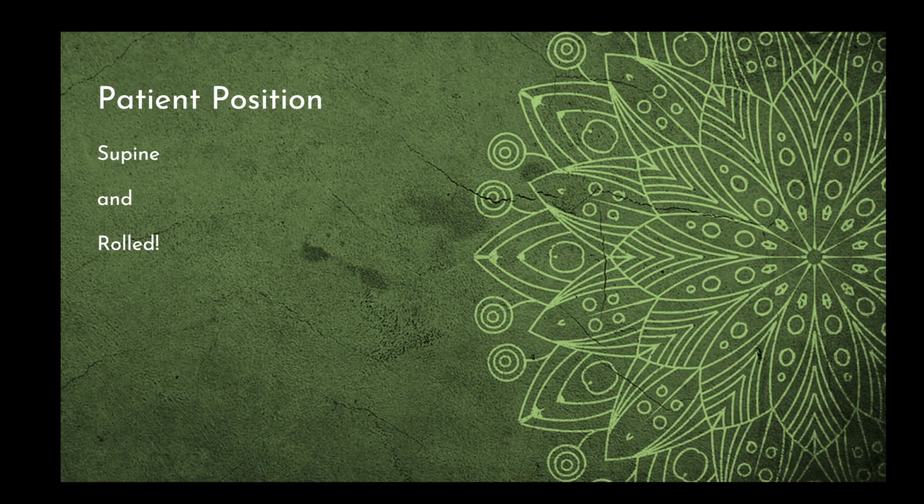And when you change the position of the gallbladder, it tends to shake things up a little bit. So if the patient has those gallstones, then those are going to roll into a different area typically. If they have sludge, that'll move into a different area. Or if they have like little debris within their gallbladder, that'll kind of kick it up, and we'll be able to see that when they roll, and then we can document it.